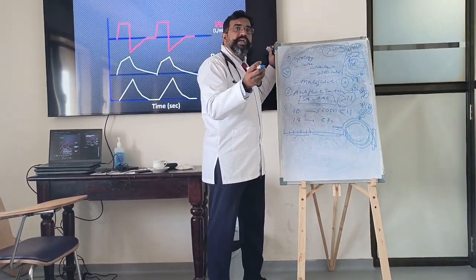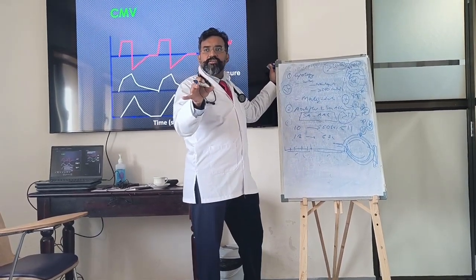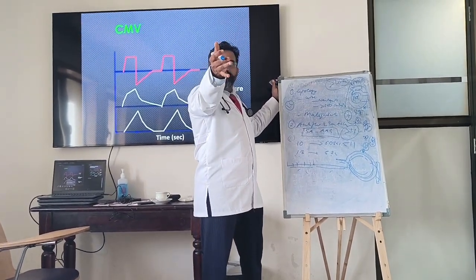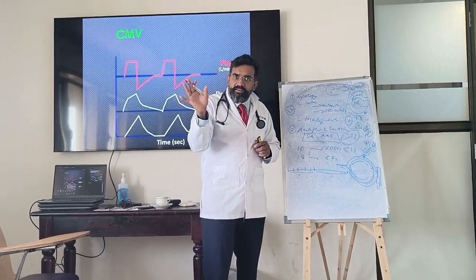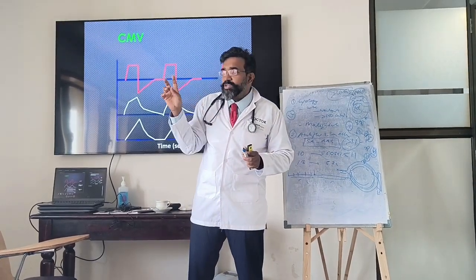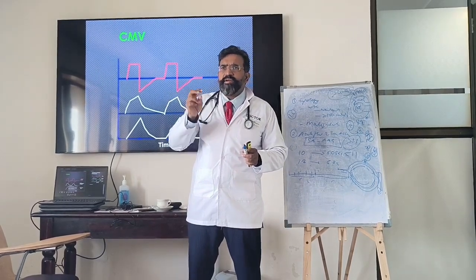So if I said +2, and the flow change is +2, the ventilator initiates the breath. Understood? So now you understood pressure trigger. Pressure trigger once more: the patient takes a breath but the pressure is changing. There's no flow change, only a pressure change, and the ventilator is set to find the pressure change.